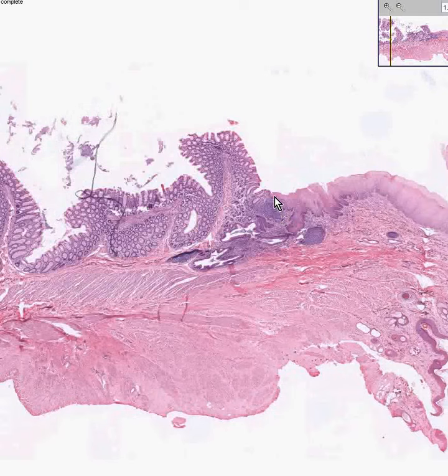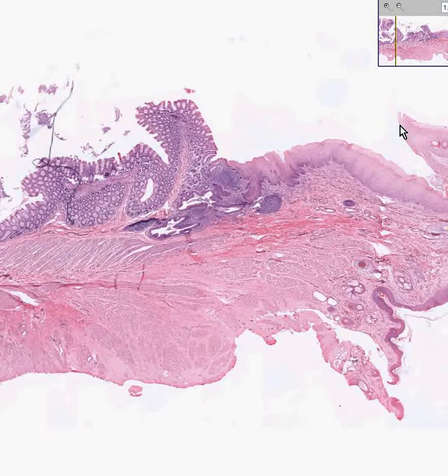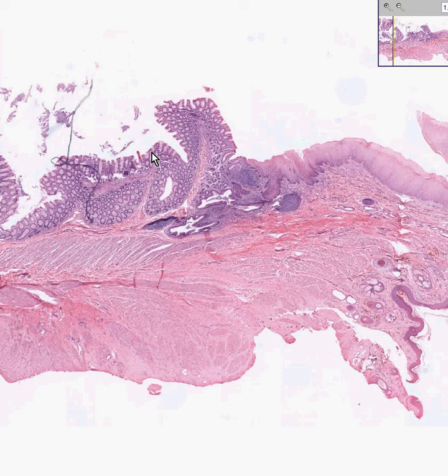And even though it looks kind of nice and quiet, this squamous area is most likely seen grossly as being very shiny and thick and leathery on the surface, whereas this columnar area here is generally very much oozing mucin, and it is going to look a lot more delicate because technically it's only one cell.